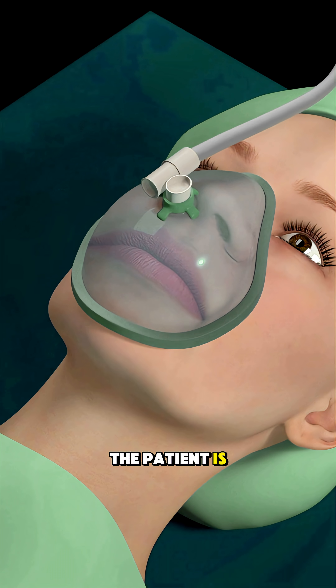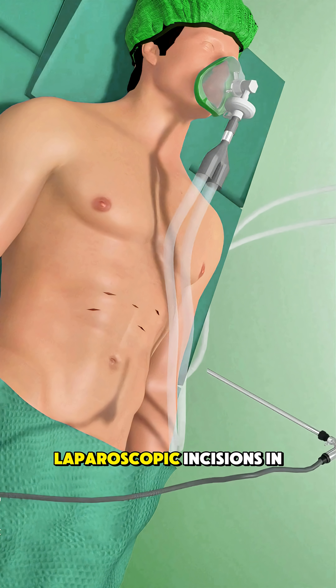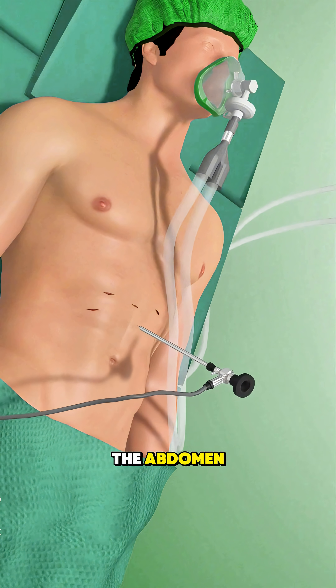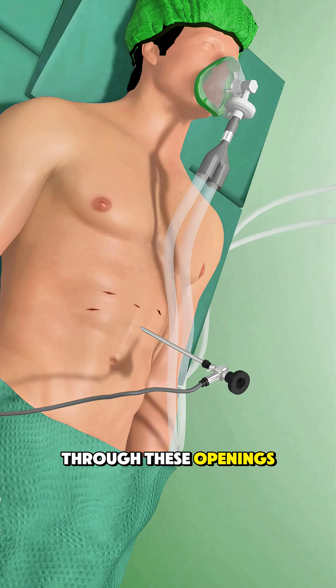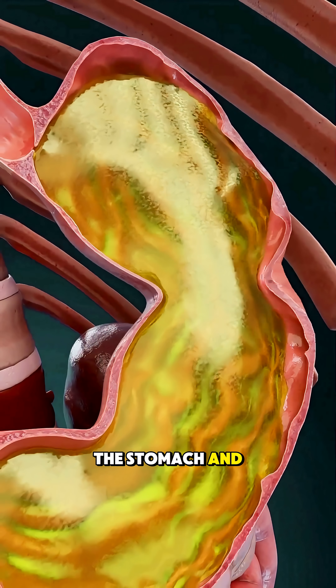During the procedure, the patient is placed under general anesthesia, and the surgeon makes a few small laparoscopic incisions in the abdomen. Through these openings, a tiny camera and instruments are inserted to view the stomach and esophagus.